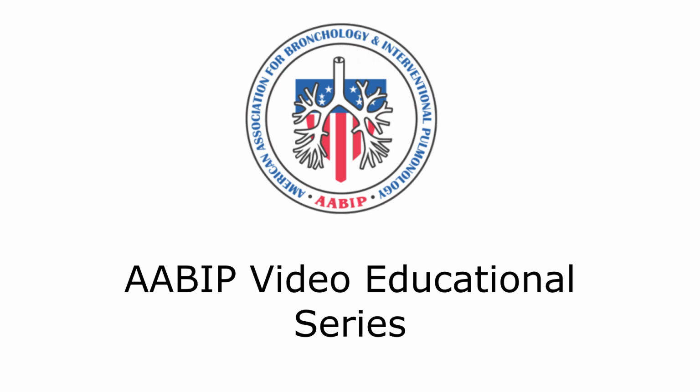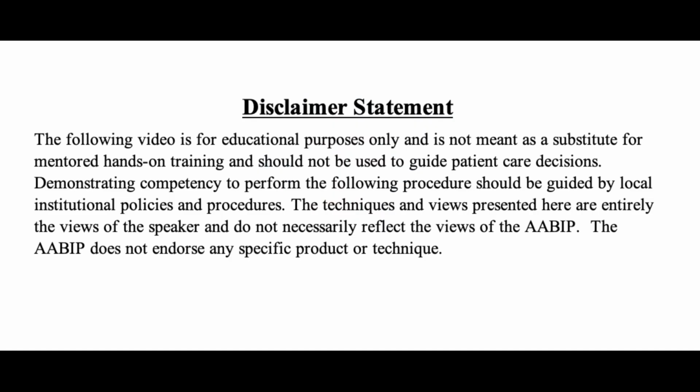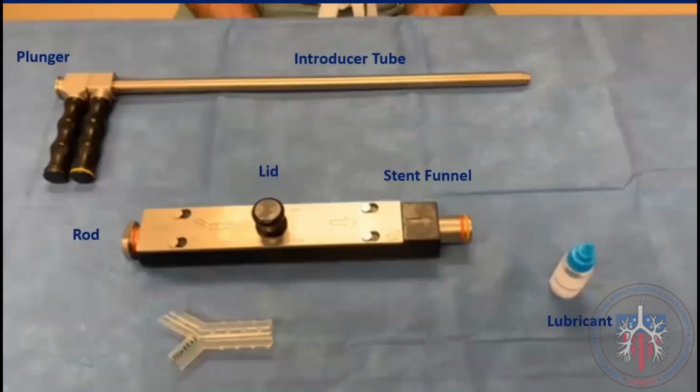In this video, we will describe how to load a silicone Y stent in the introducer tube in preparation for subsequent deployment in the airway. For this, we will need the introducer tube, the plunger, the Y stent loader, and a lubricant.